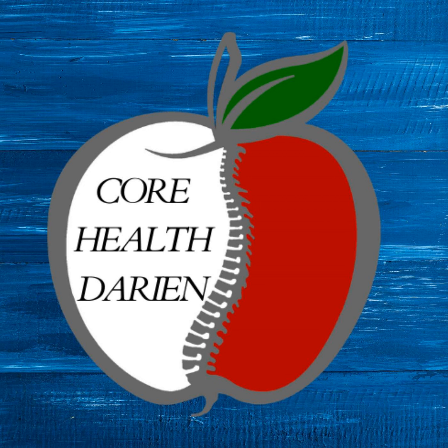There are many, many tools, and if you have chronic low back pain, this could be your answer to ending your low back pain. It's not just Graston for these adhesions that form in the back. No, there's a lot more to it, and that's a topic for another day. But Graston is a soft tissue treatment that addresses adhesions. And adhesions are a band of scar tissue, and they can be quite painful. Some adhesions are less painful, but over a period of time, they're going to become more painful and restrict your mobility. Restricted mobility is going to add to arthritis and just more chronicity to your back pain problems.